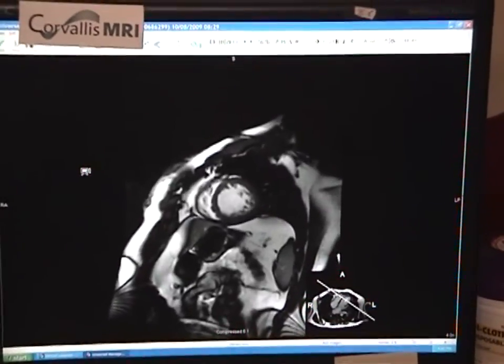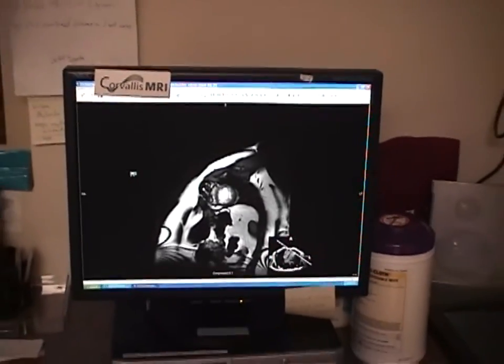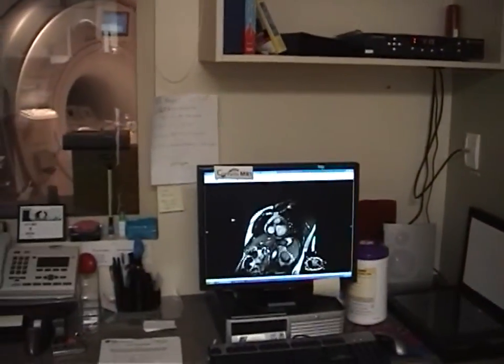So you can do this with the 3T now? Yes. And we do a lot of these mainly right now at the 1.5 across the street as we're learning the software and the nuances of the machine. So the 1.5 will do this also? Yes. I'm not sure if this one was done on the 3T or the 1.5.